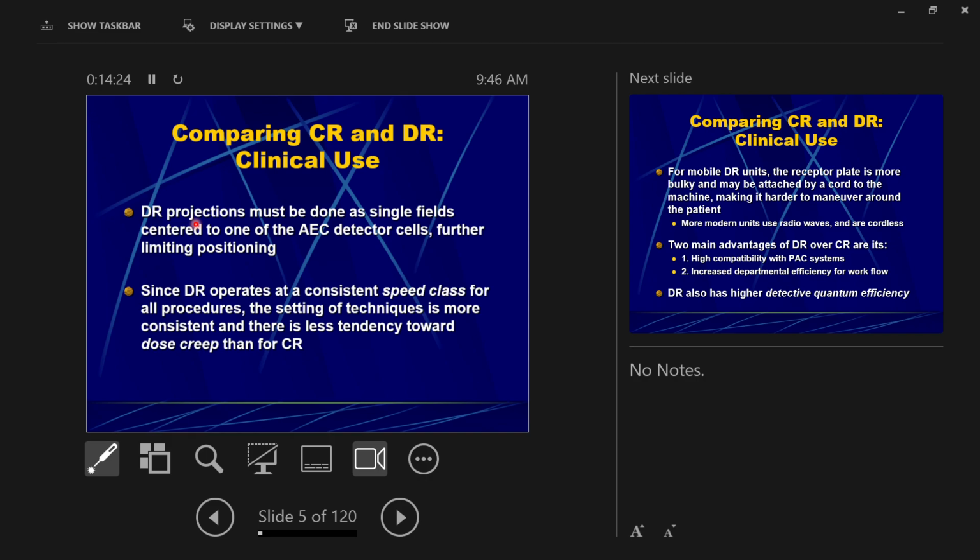The added advantage here is that each time you take the thing to the processor, it takes about a minute or two to process the image. So if I took this three separate times to the processor, I'm now taking three to six minutes of processing time. If I only have to take it to the processor once, I'm using a minute or two of processing time. So I'm saving time. Right? It was saving money and saving time, which is why we did multiple projections, multiple images on a single plate or single piece of film.